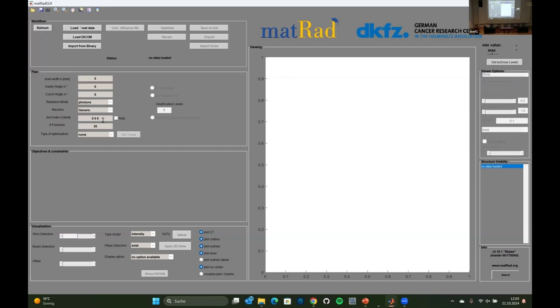Yes? Do you have a question from the on-site participant? Yes. So it looks like I have this standalone version, so some of the options are grayed out. And is that enough for today's? Yes. Okay, thank you.